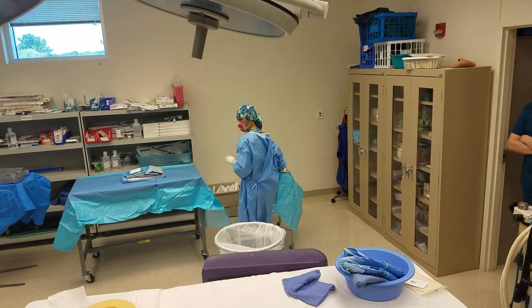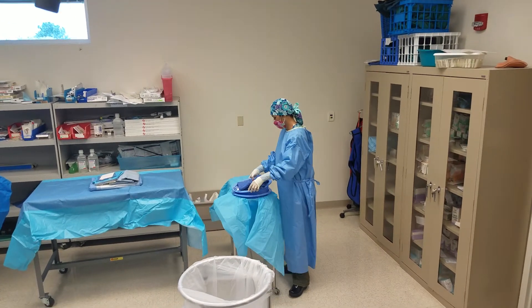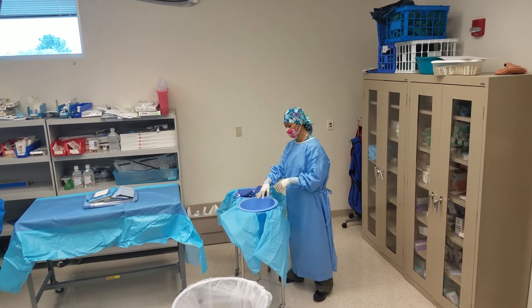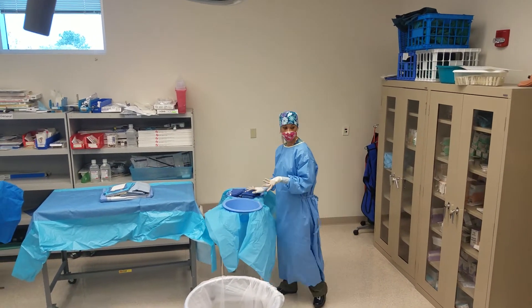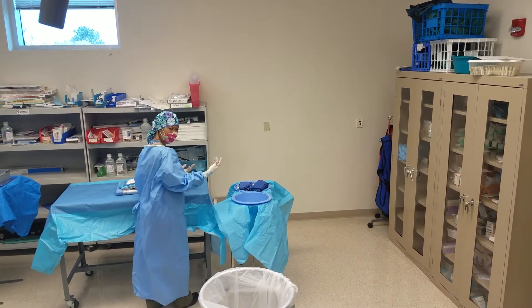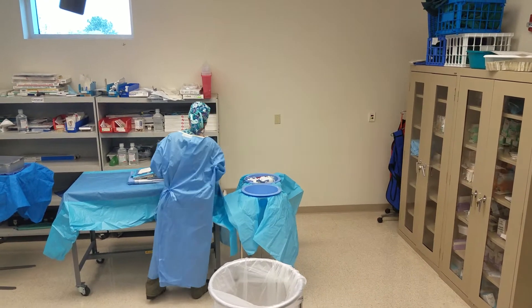So what do I do first? Separate my patient. Correct? So I'm separating my patient. So be careful where your margins are. So you see this empty space — so I'm already here. Can you guys see me? Move my back. All right, so I'm going to take my towels and then I'm going to make my fold.